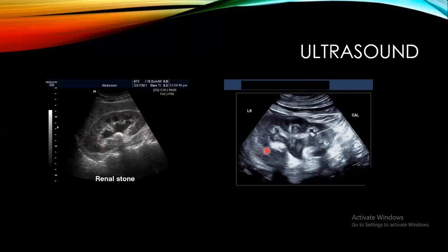نرجع على هاي الصورة. This is kidney. الحقيقة هنا ما مبين الليفر، most probably this is left kidney. Here is the part of the spleen. دائما السبلين يغطي left kidney, and this is the upper pole. And this is the dilatation of the calyx, and also there is an echogenic lesion in the lower pole of the kidney, and dilated pelvis with dilatation of the part of the ureter.